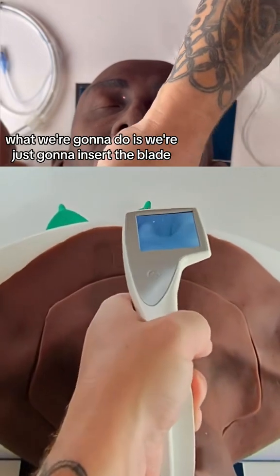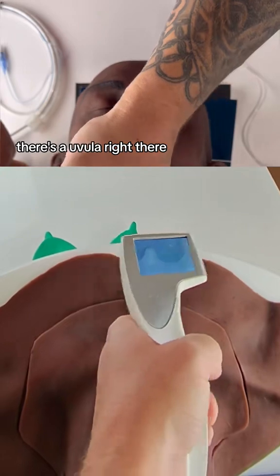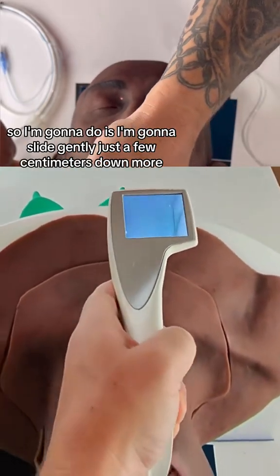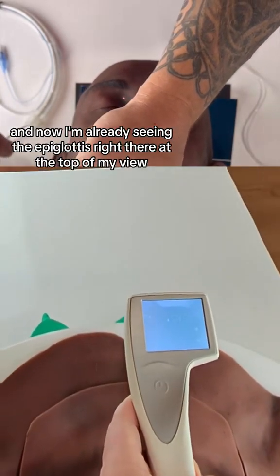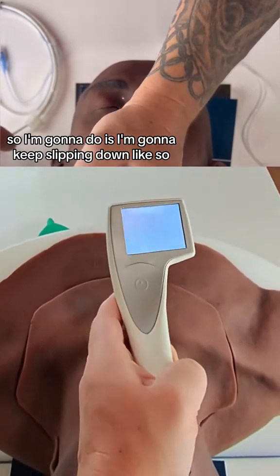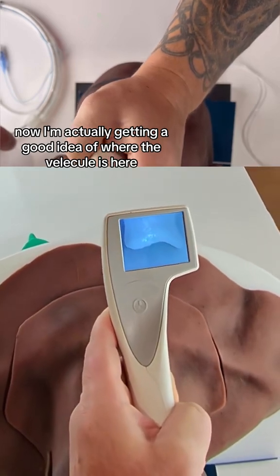We're just going to insert the blade and take a look around. There's the uvula right there, and part of the tongue. Then I'll slide gently just a few centimeters down and take another look around. Now I'm already seeing the epiglottis right there at the top of my view, and I'll keep slipping down.